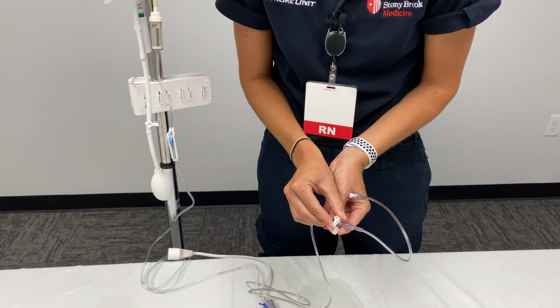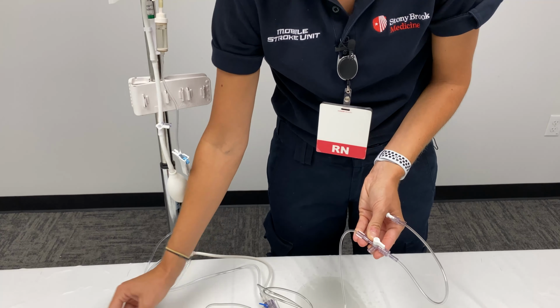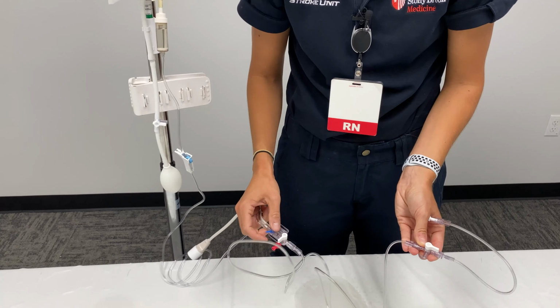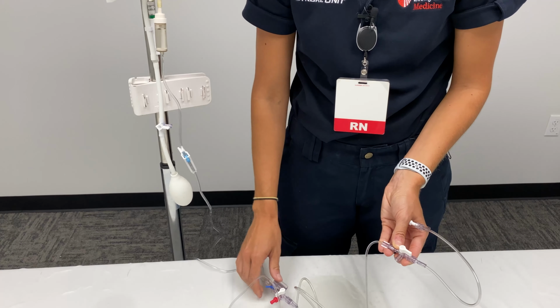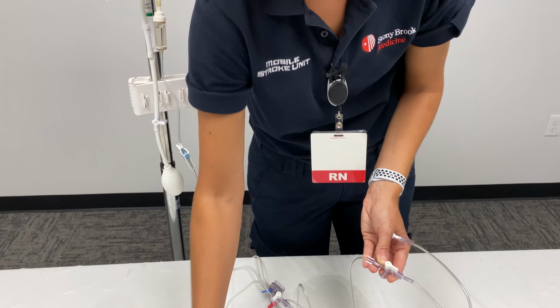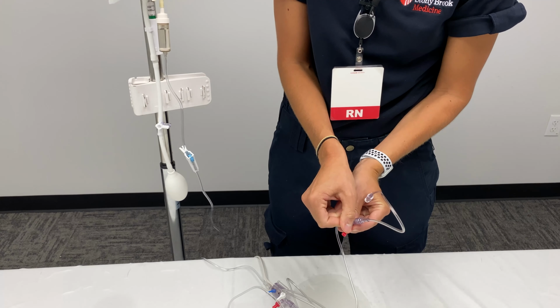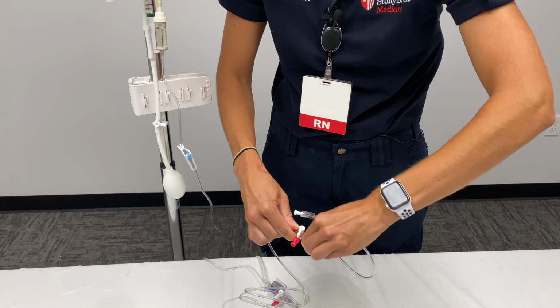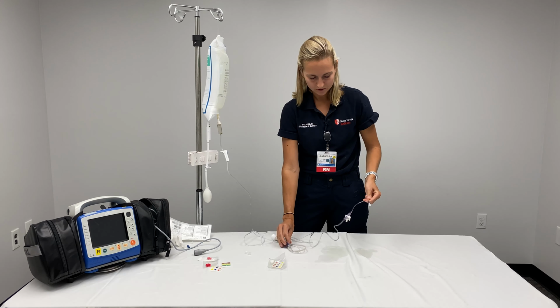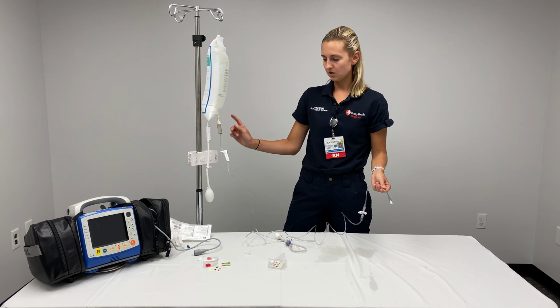Same thing: turn it off in the direction opposite of your bag, remove your cap, flush from your main port until all the air is out, and then recap it. And again, turn it off towards the cap. Sometimes you have to make sure your ports are tight. And then your last one, you can just flush. And then your A-line is completely flushed.